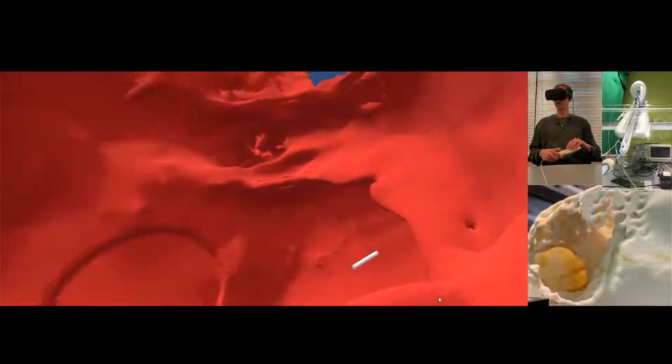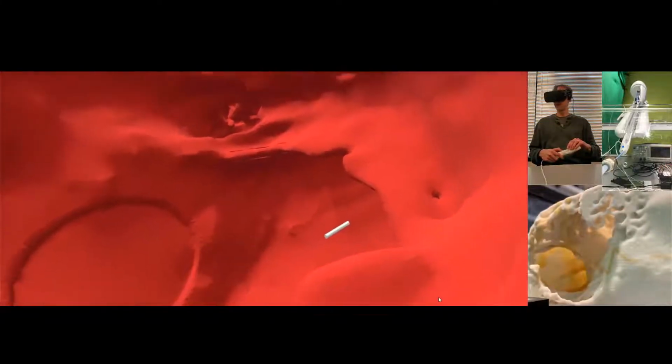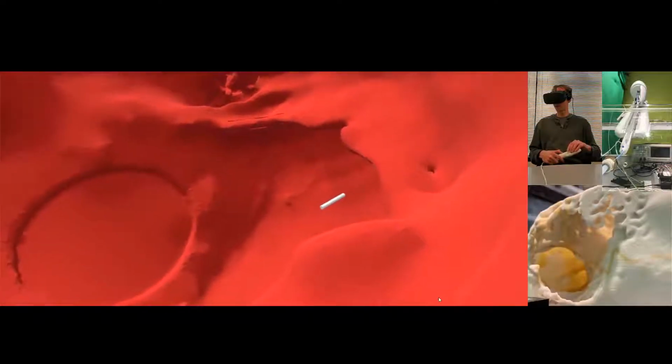So I'm in the right atrium here, and I get a view of the appendage, the superior vena cava, the fossa ovalis, and the tricuspid valve. And there's my catheter tip coming up the IVC.